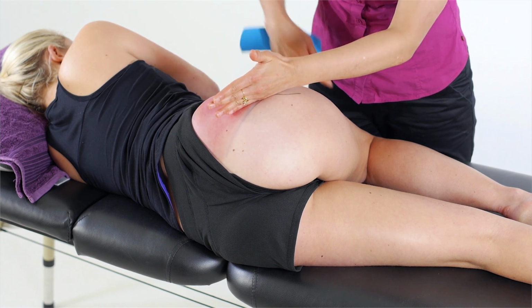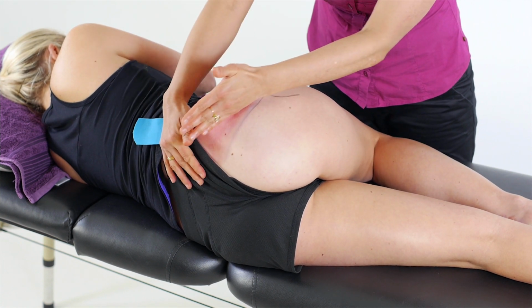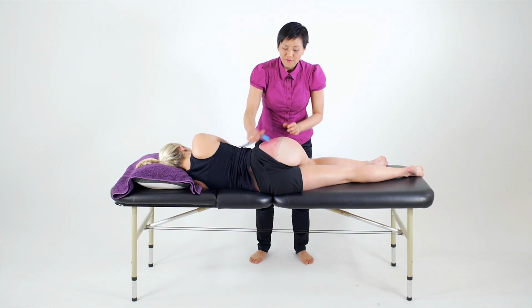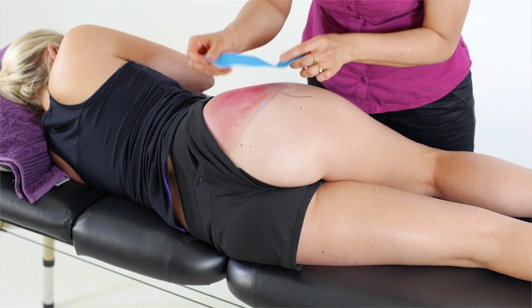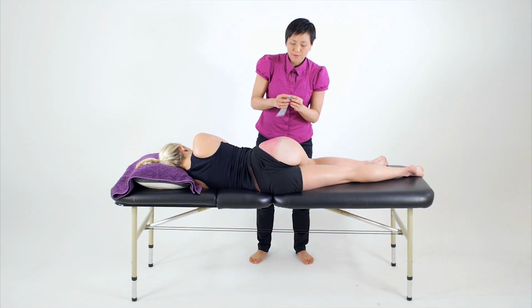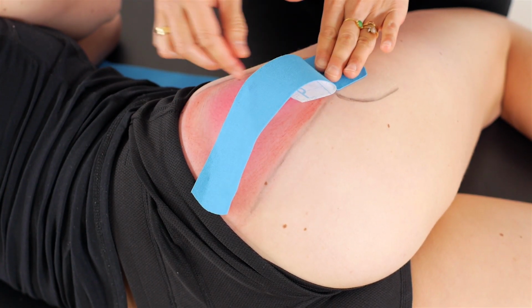What we're going to do then is position the lower part of the leg, the femur, in a continual line from those fibers. So if the fibers are in this position, we'll move the pelvis down so it's a continuation of those fiber lines. From here, we measure a length of tape from the greater trochanter down to, and up towards the posterior superior iliac spine there. And so we remove the tape off the backing and let the tape settle to 0 tension before applying it on the lateral greater trochanter.